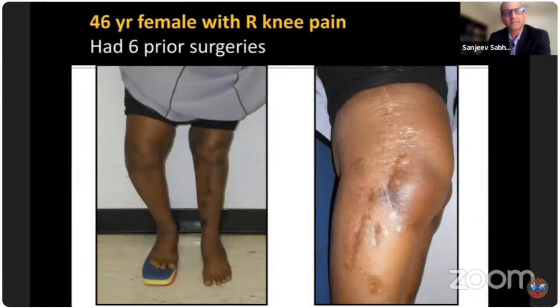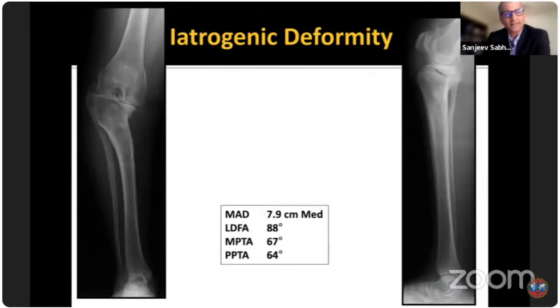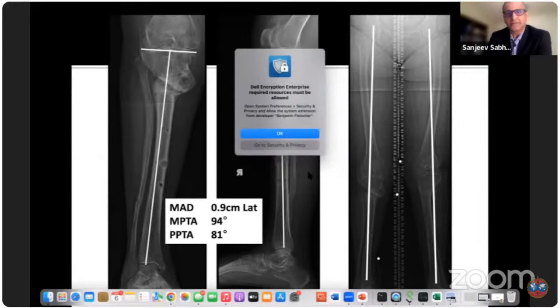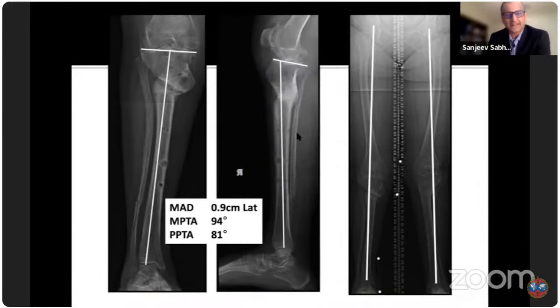And then here's a final patient. It's an adult who was ready for knee arthroplasty, but the arthroplasty surgeons couldn't do anything because of the extreme residual medial translation of the distal fragment, despite a near tricompartmental arthritis. So really, my goal was just to reestablish and translate back the distal fragment. And I think the picture on your left just shows how much of that iatrogenic translation needs to be corrected. If that had been addressed with the previous surgeries, I think that would have made life easier.